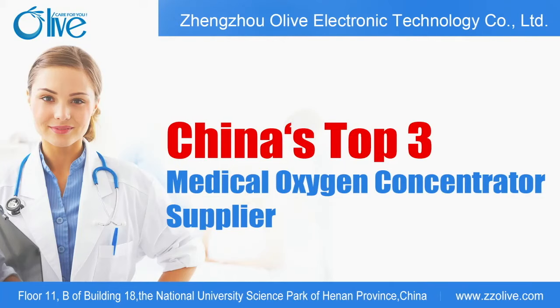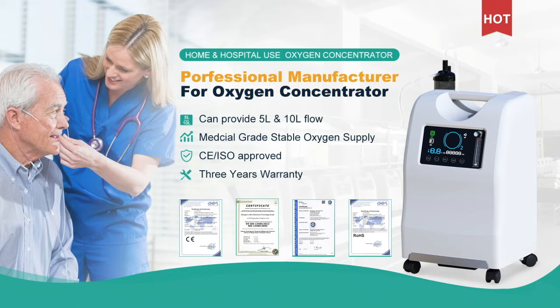Welcome to the Olive Oxygen Concentrator video. Today, we will introduce our hot-sell model to you.